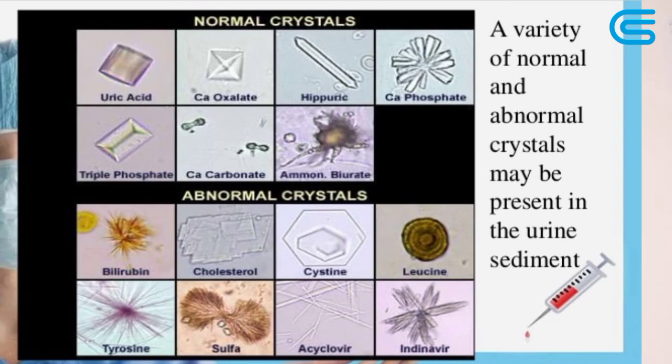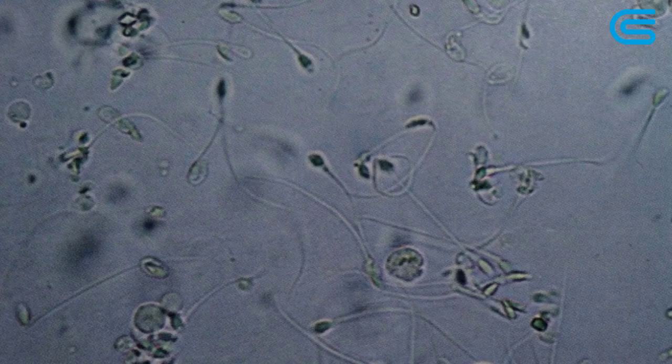Unorganized substances are crystalline and amorphous materials which are suspended in urine, and on standing they settle down and sediment at the bottom of the container. Their presence depends on the urine pH. Mostly crystals that appear in acidic urine dissolve in alkaline urine and vice versa. Calcium oxalates are found in both acidic and alkaline urine. Spermatozoa are a type of cell that is found in urine.